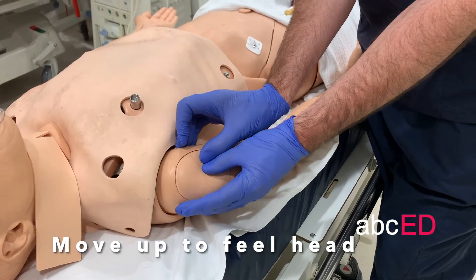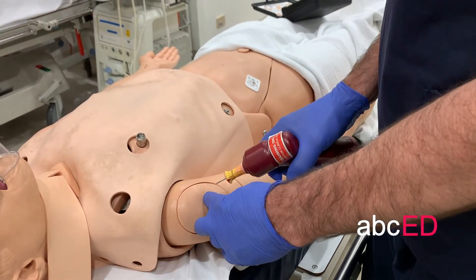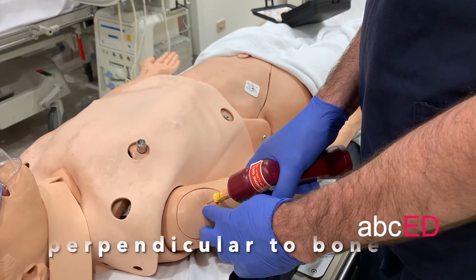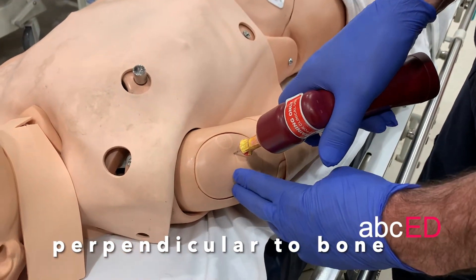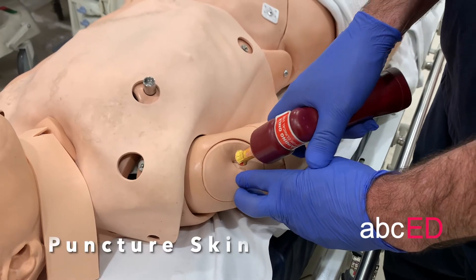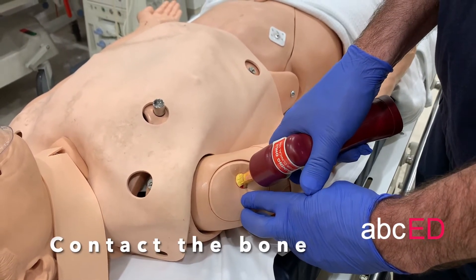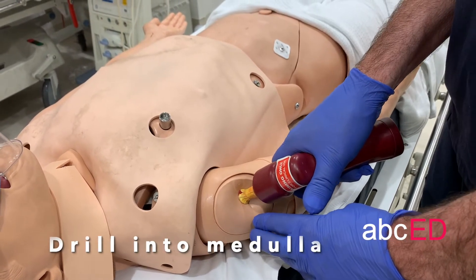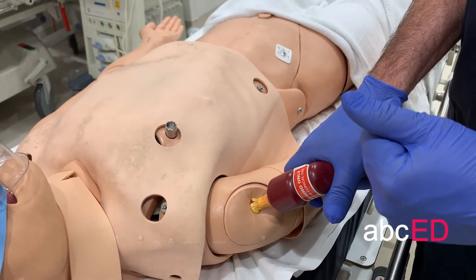That's going to be your puncture site — that's where you need to go. You'll be coming in at a 45-degree angle from the frontal plane, perpendicular to the curvature of the bone. First puncture the skin, then contact the bone, then press the trigger. You'll feel it pop into the medulla and then you know you're in place.